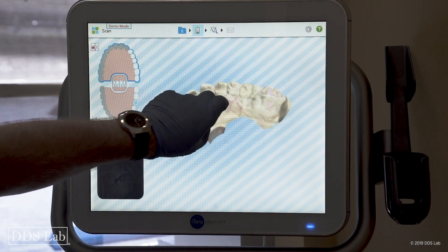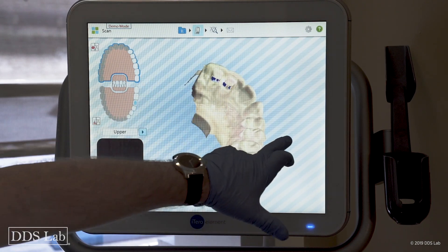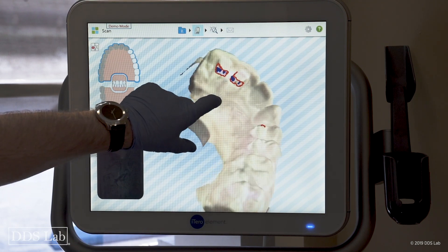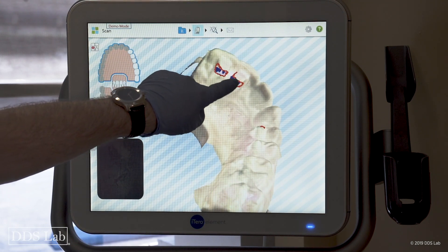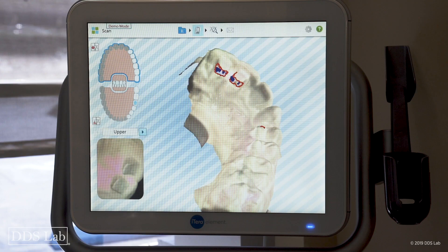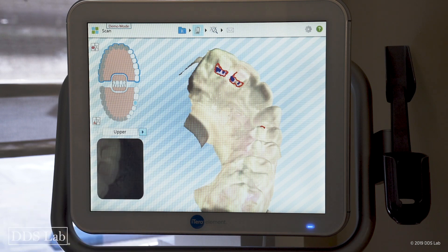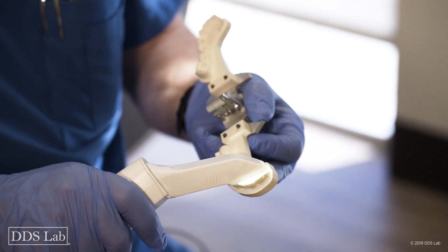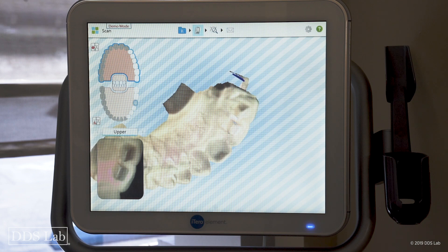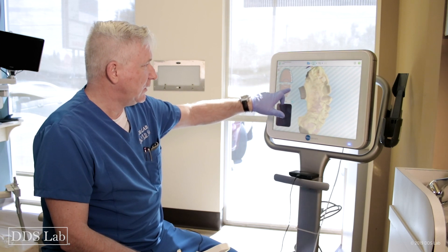Now I'm going to analyze my scan, making sure everything is covered. If something is not covered it shows in blue. I press the fill button on my screen — everything in blue is also marked in red, and everything marked in red needs to be captured again. I reposition my camera, compare my monochrome model with my actual camera view to find my position, turn the camera on and off, and everything is captured. We're all good.